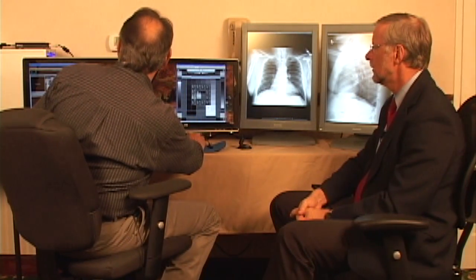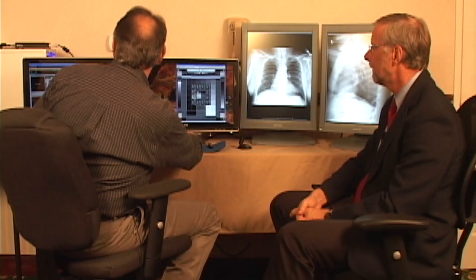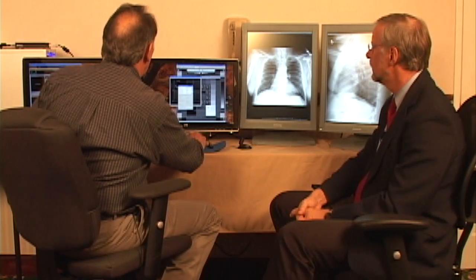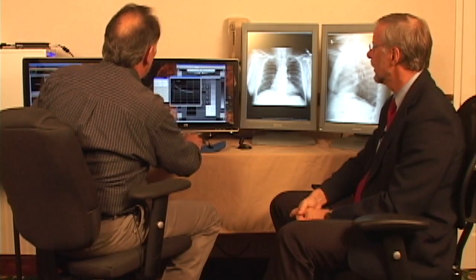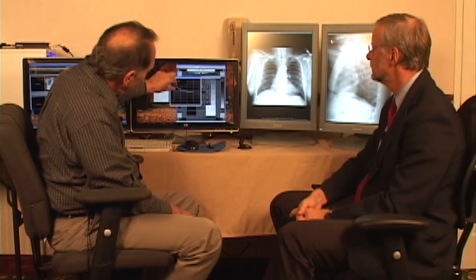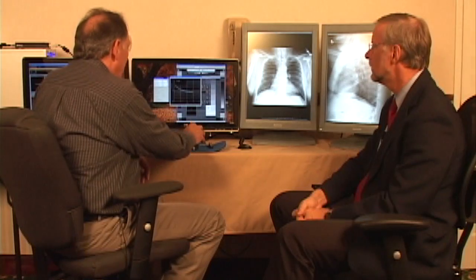If I go back to reports, the latest for that display, because it's the only one being controlled by that conformance, there are my test results. It's set right now with a plus or minus 10% band, which your camera may not be able to pick up, but there are parallel lines that sweep down. The squares are representative of the target values we wanted to hit, and the X's are what it actually measured. We have 2 points that are right on the line. But again, this is the diagnostic tolerance line for plus or minus 10%.